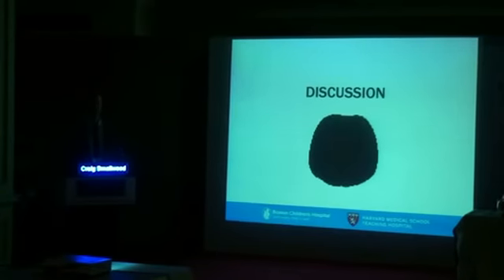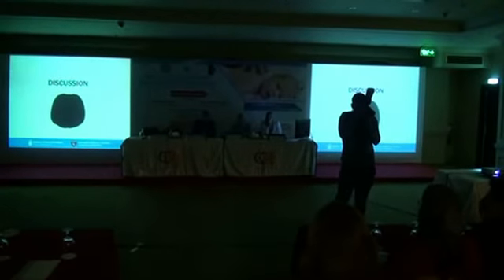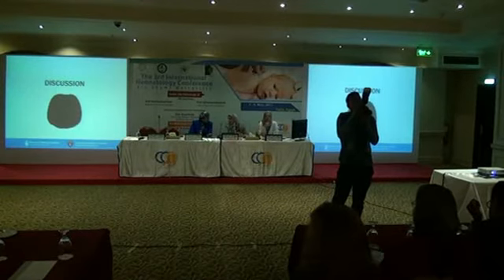I would like to ask if this technology has entered into the bedside management of the patient. Are you using it? Are you deciding, for example, to put the patient in the prone position to have better aeration of the dorsal parts? And can you modify your minute-to-minute management and ventilation according to what you see?